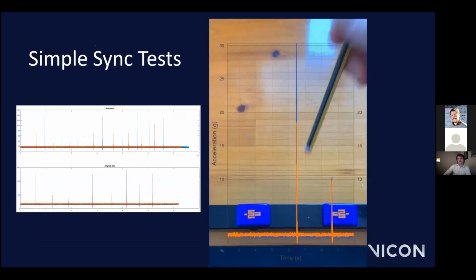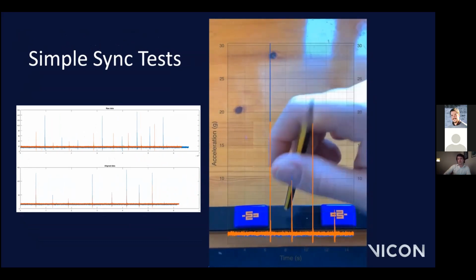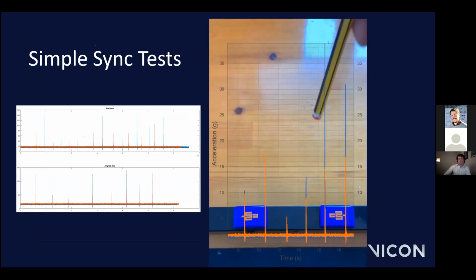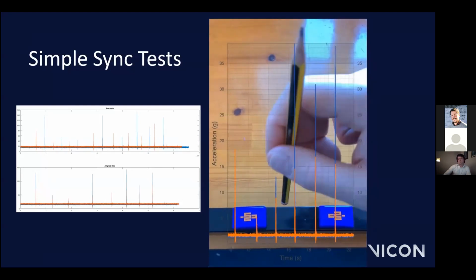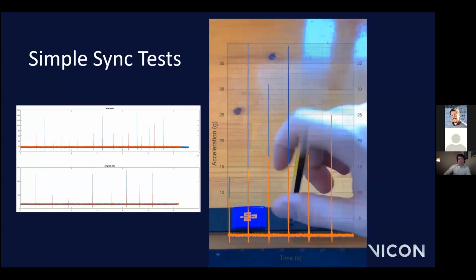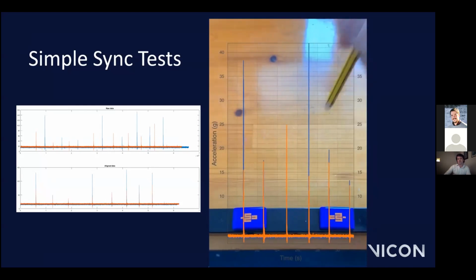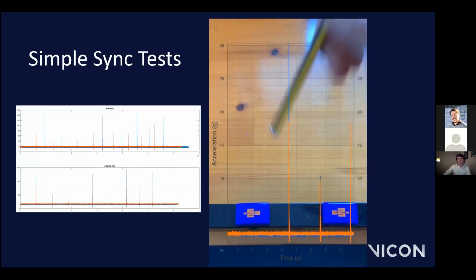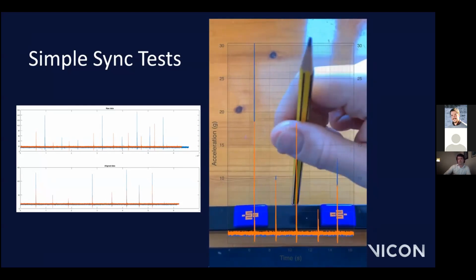We are also often asked, how are the sensors synchronized with each other when using the CaptureU app? At the start of recording a trial, the sensors are synchronized by a radio beacon, which is broadcast from one sensor to the others. And once synchronization is complete, all of the sensors are aligned to within 100 microseconds. A simple test can be carried out to validate the sync by attaching multiple sensors to a rigid object, such as a metal bar, and repeatedly striking the object so that an impact is recorded for each sensor.